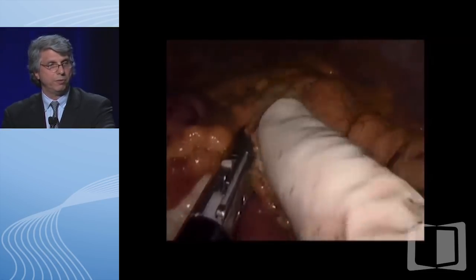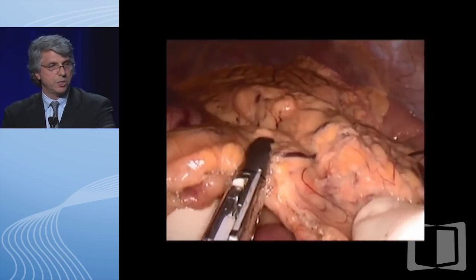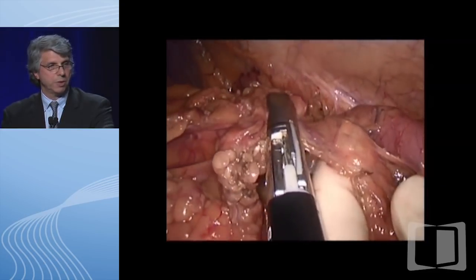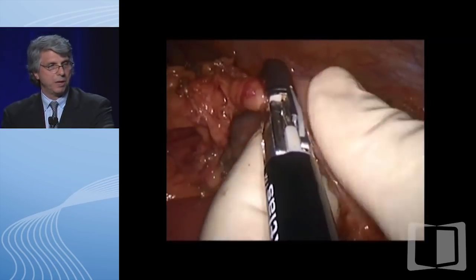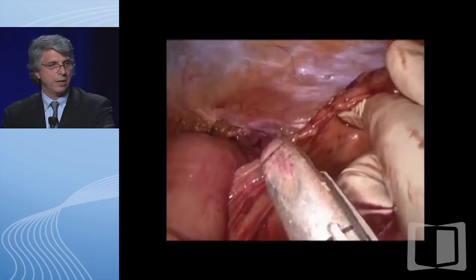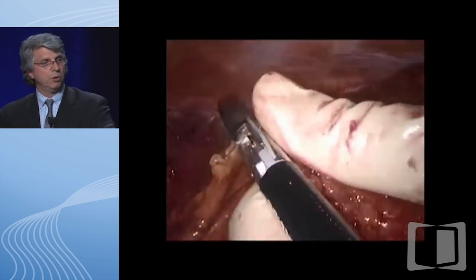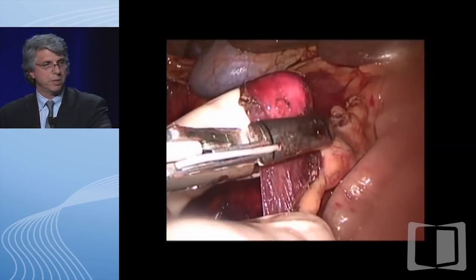You try to stay away from the splenic bed and minimize the incidence of injuries. That structure on the left is the stomach, and we're staying away from that as well. We've actually had one patient where the stomach was inadvertently injured, so we're very careful about that now. We come around the splenic flexure, continuing our dissection down towards the left-hand side of the abdomen.